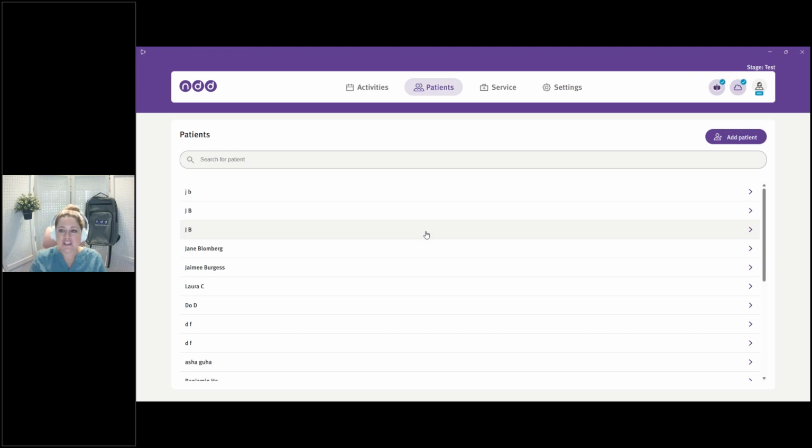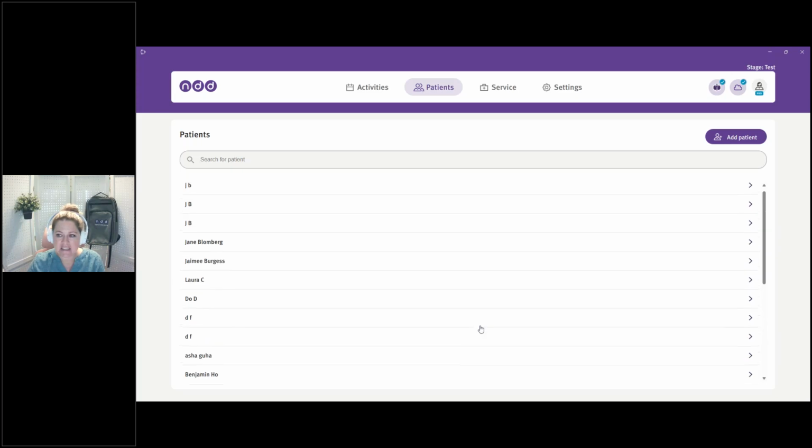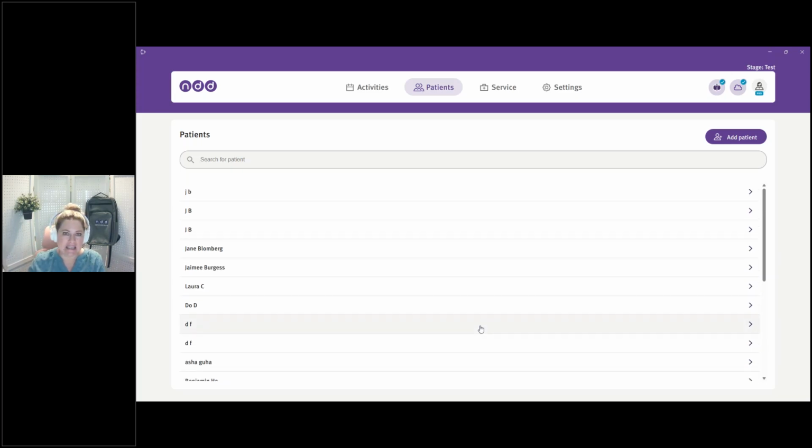So while the physician might be located at clinic A, he is still able to access the tests from clinic B, C, and D, from all of those spirometers, which makes the ease of use of this so much nicer. In the future, we will be able to group a little bit more in detail by location, by organization, by technician. All of those things are coming, but right now being able to group by organization is just a huge plus.